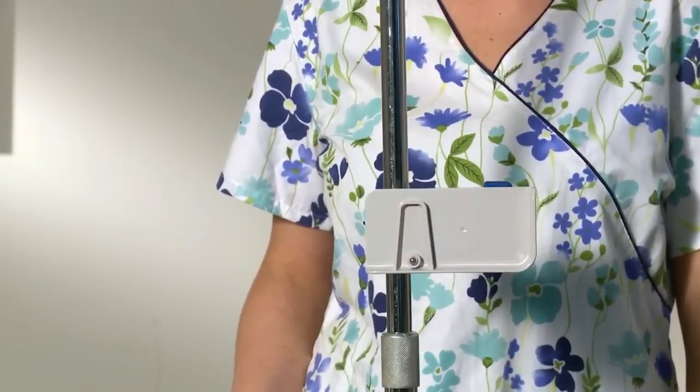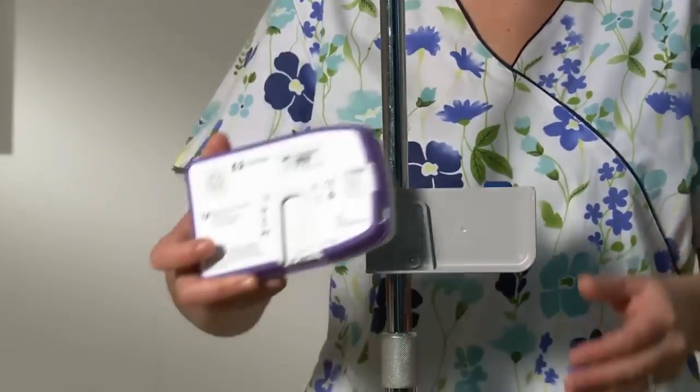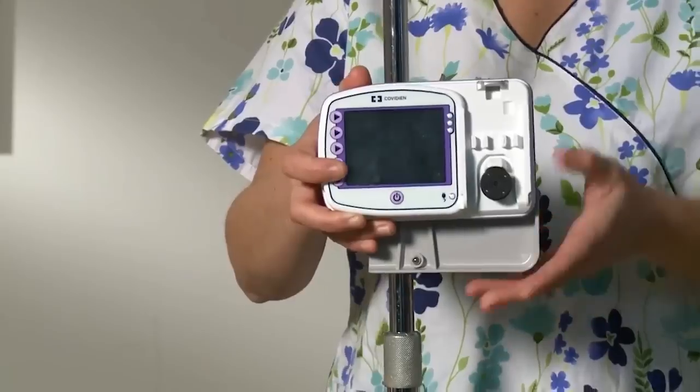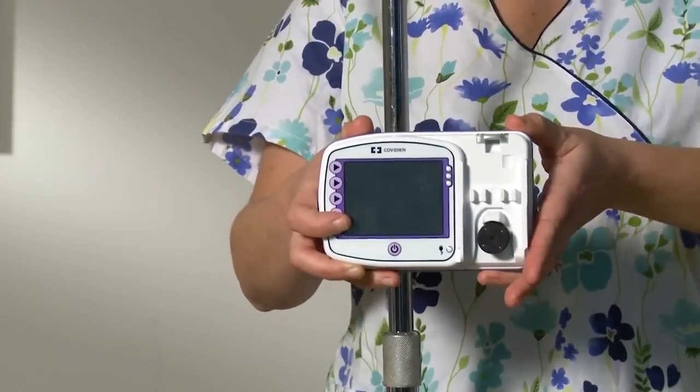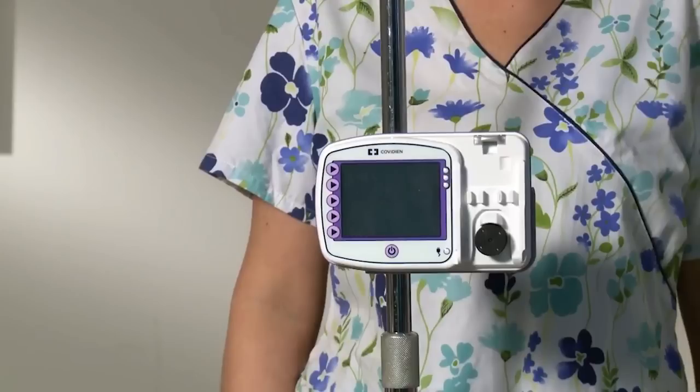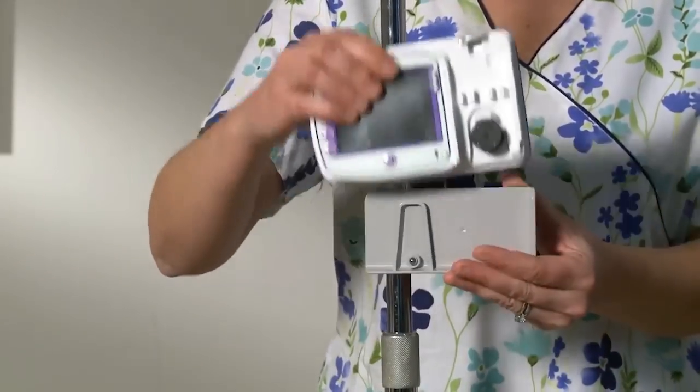Rotate the latch plate connector to look like an upside down letter U. Match the U on the back of the pump with the pole clamp latch plate and slide the pump down until it has been properly seated. To remove the pump, gently pull upward on the pump until it pops upward off the latch plate.